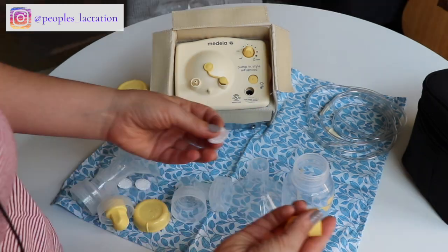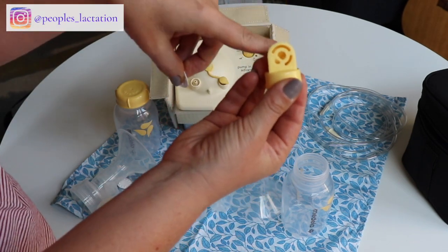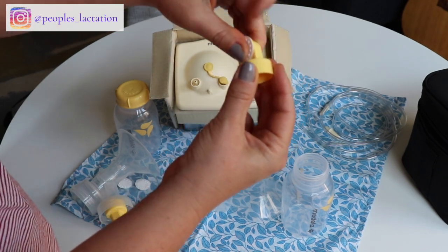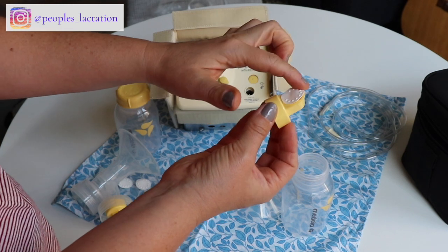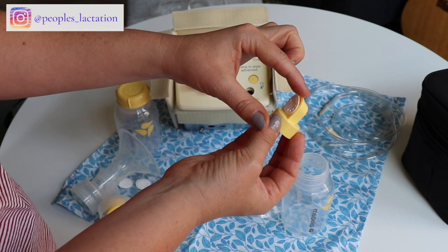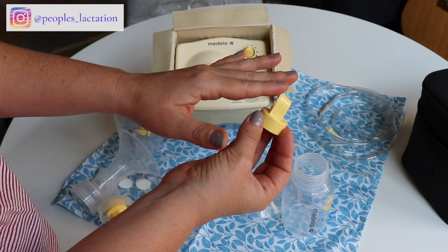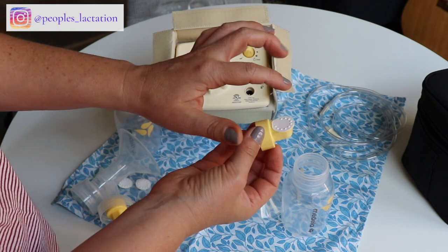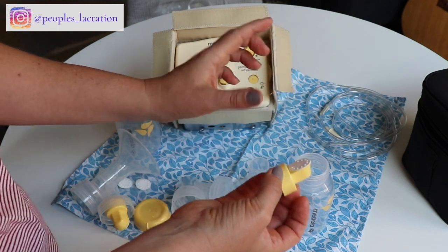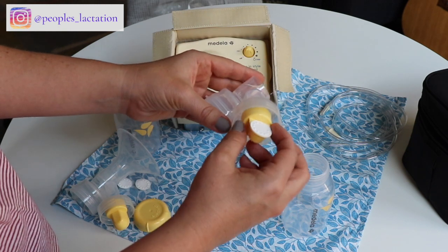When you put this back together, the flap inserts into this little half-moon-looking hole, and you want to make sure that this flap is completely flat. If this flap is elevated even a little bit while you're pumping, you are going to notice that that side may not have suction. So if you're ever pumping and one side isn't working, this is where you could start your troubleshooting — make sure this little white flap is laying flat.